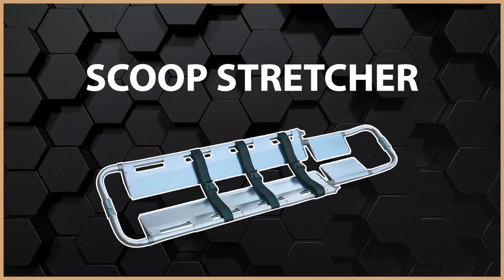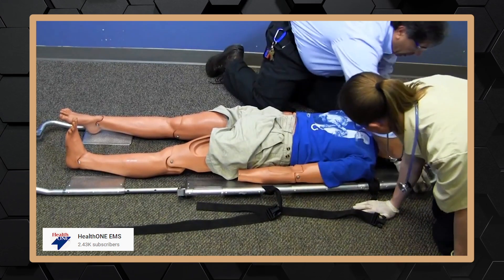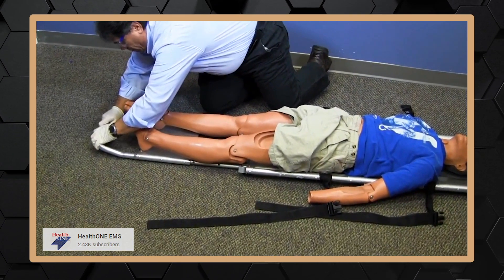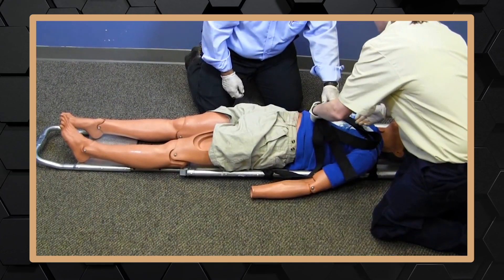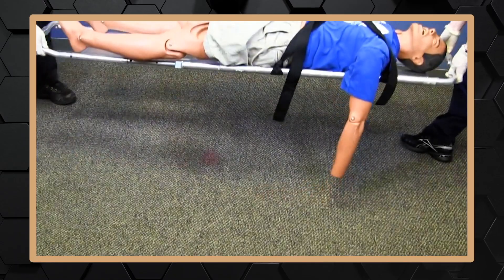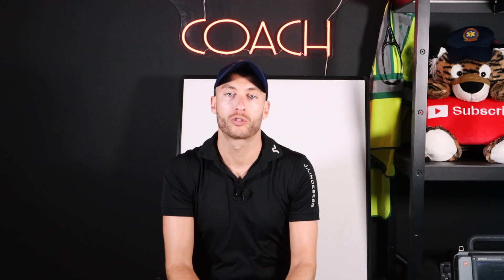One is a scoop stretcher. Kind of like it sounds, it scoops the patient up. It's basically two metal pieces that come together and scoop underneath the patient. You're able to roll the patient and just scoop right into them and then lift them up. From there we can bring the patient to the EMS stretcher and then to transport.